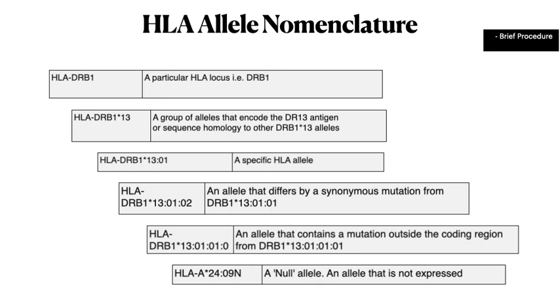I'm going to skip this slide fast, because if you want to, you can pause the video and see that the way it's written has different meanings. These are high resolution, so much information can be generated by high resolution HLA typing. It is usually done these days by NGS platform because of the thorough output, and there are new technologies available which can uncover even new antigens.